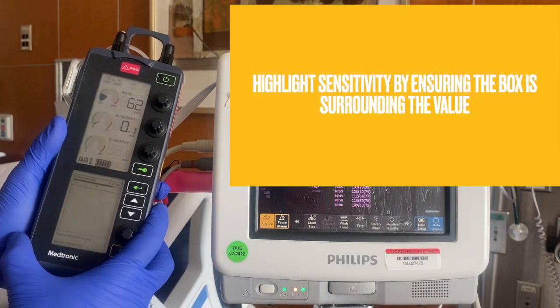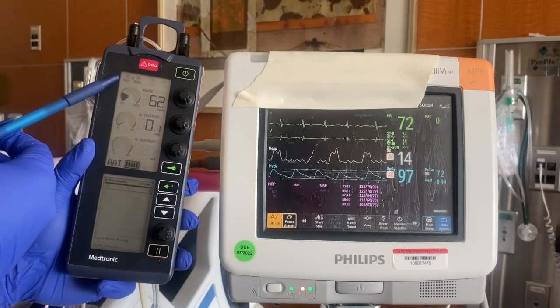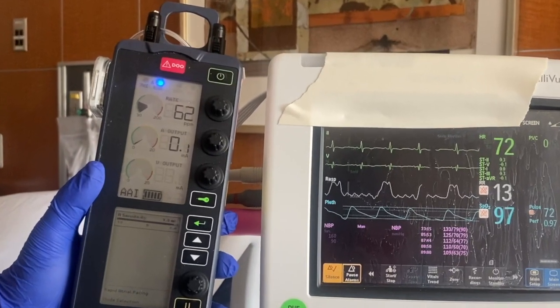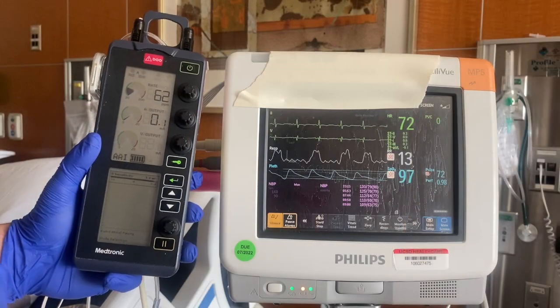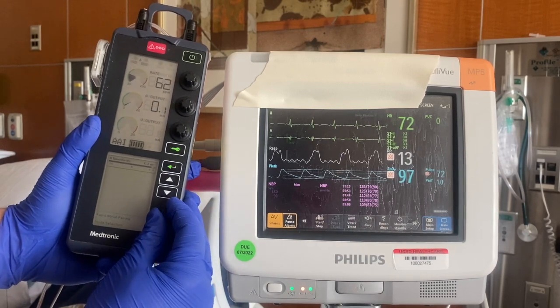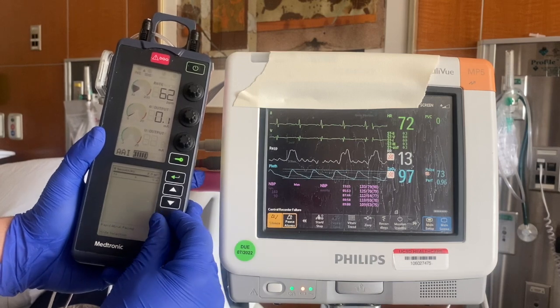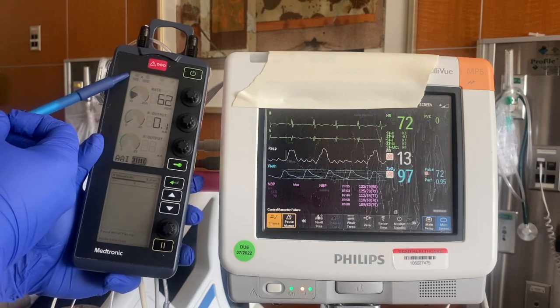Highlight sensitivity — sensitivity is in the box below. Notice the sensing light flashing rather than the pace light. At this point you will highlight sensitivity and decrease it by slowly dialing counterclockwise while watching to see when the pace light begins to flash. Watch for when the pace light up top — the light green — is flashing.